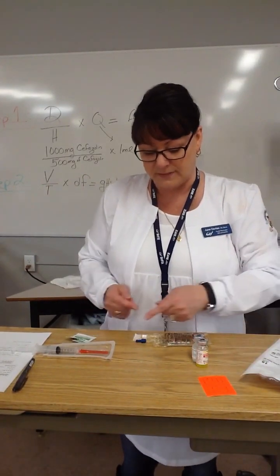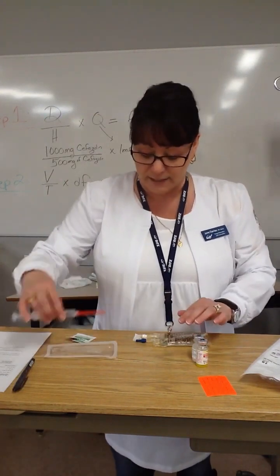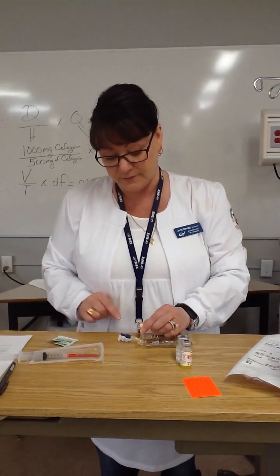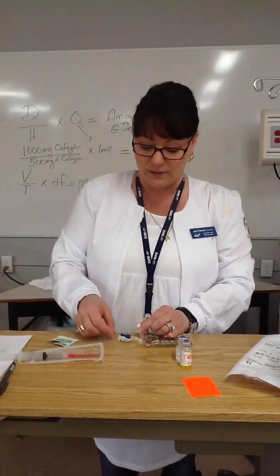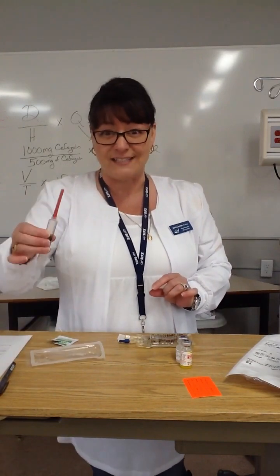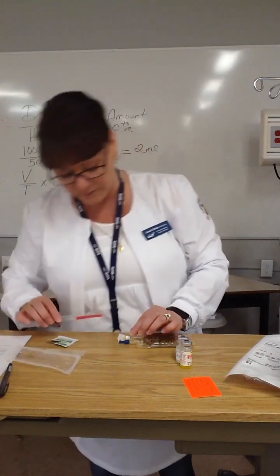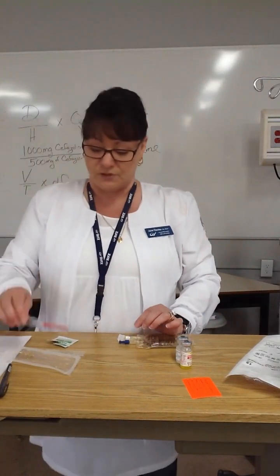Okay, I'm leaving that there. You can see that I'm leaving this bag. I'm a right-handed person. I'm going to be injecting this port from this angle. You do not want to be lifting that port up off of the table. This is how you accidentally stick yourself with this very large 18-gauge sharp needle. So I want you to practice keeping the port down and level with the table and coming in from that angle so that you don't pierce yourself.